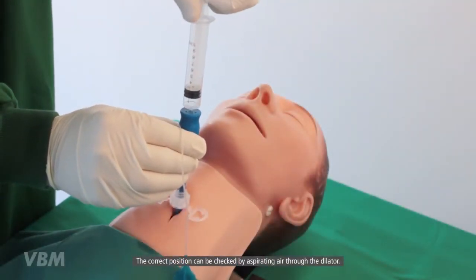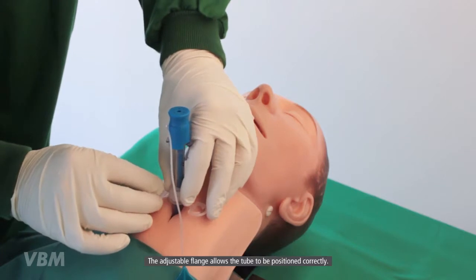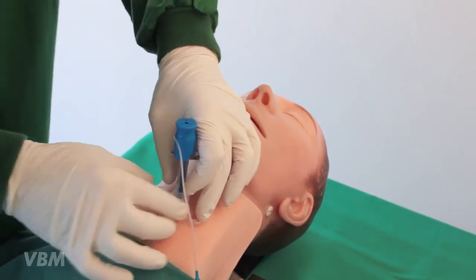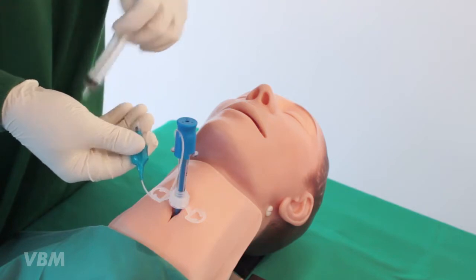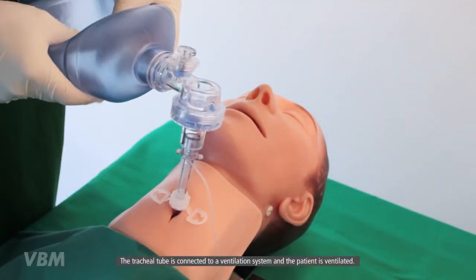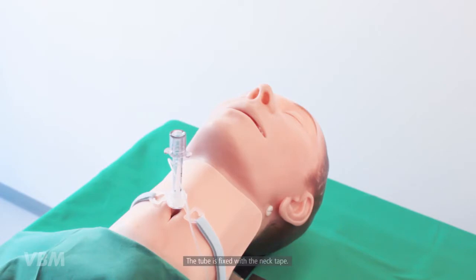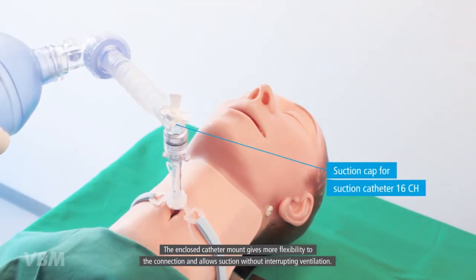The correct position can be checked by aspirating air through the dilator. The adjustable flange allows the tube to be positioned correctly. The cuff of the tracheal tube is inflated. The dilator is removed from the tube. The tracheal tube is connected to a ventilation system and the patient is ventilated. The tube is fixed with the neck tape. The enclosed catheter mount gives more flexibility to the connection and allows suction.